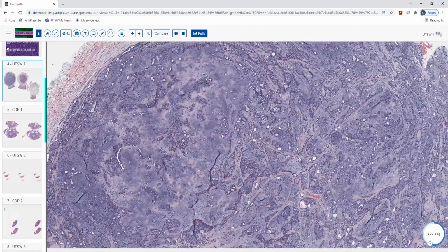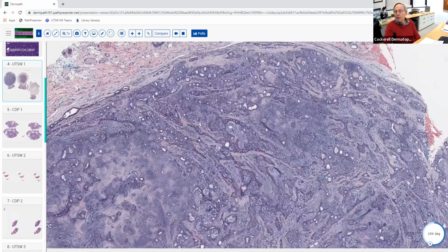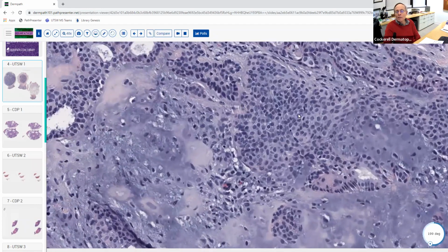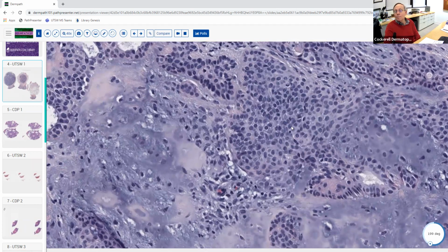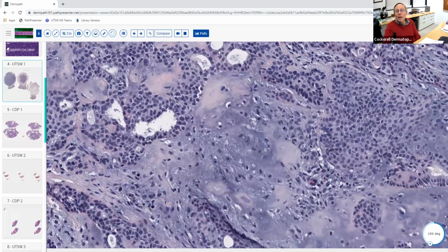Is it mixed tumor, like mixed chondroid syringoma? Yeah, basically a mixed tumor of the skin. The other name for that is chondroid syringoma. And that is thought by most experts to be a lesion with eccrine differentiation. And if you see eccrine differentiation, where you get the small little glands without any obvious apocrine differentiation.